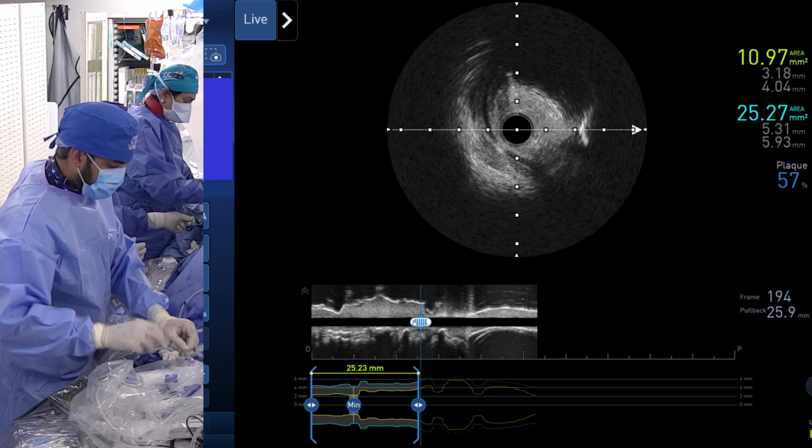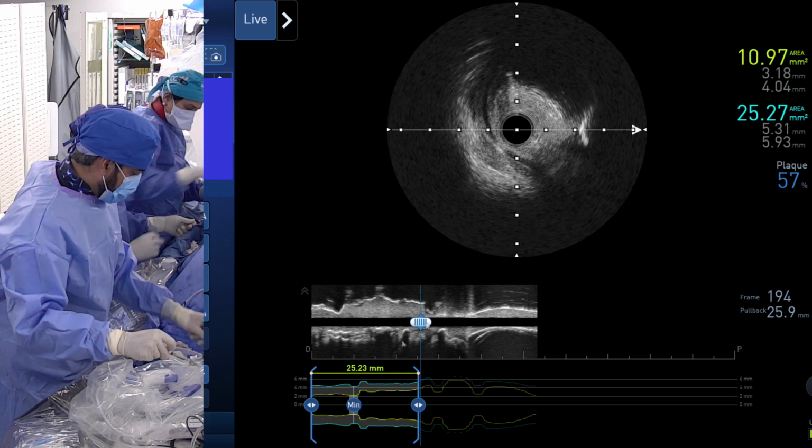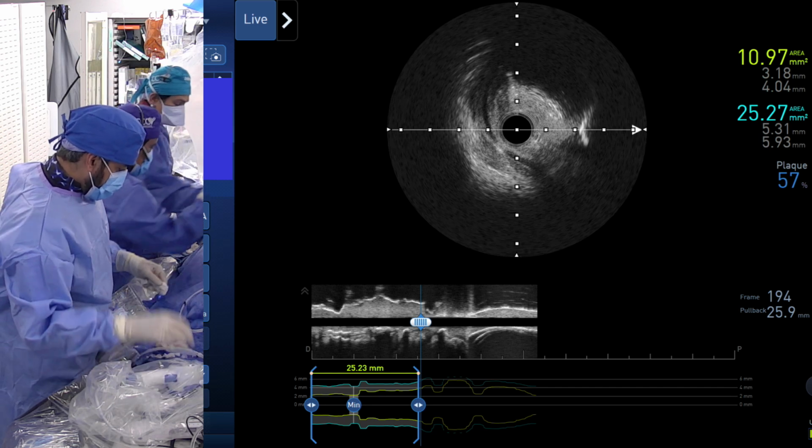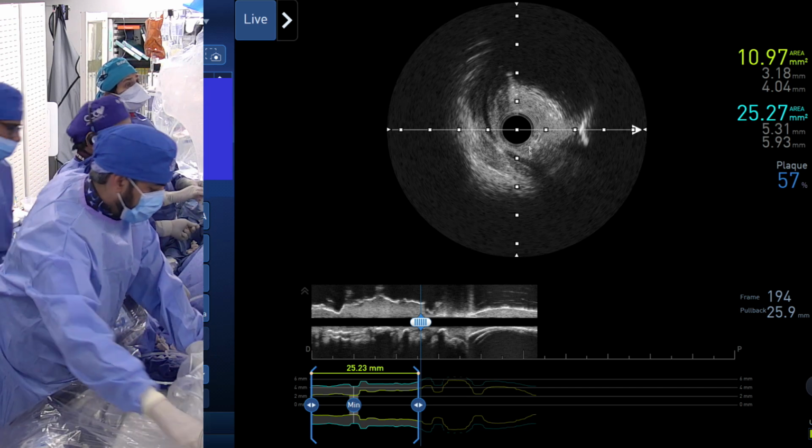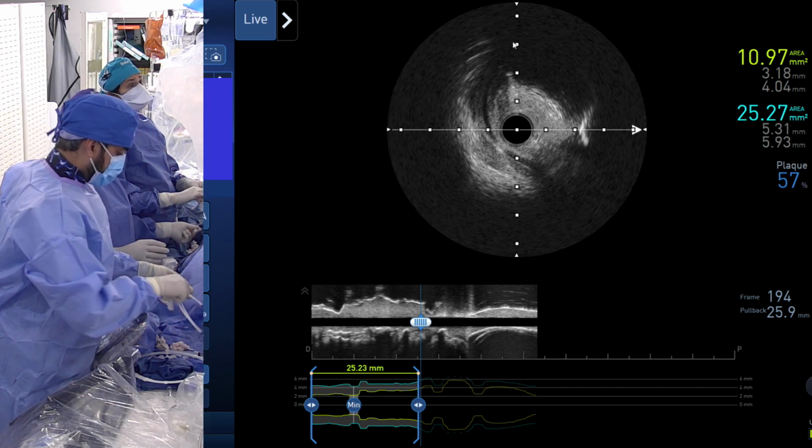So I'll remove the rota wire. Now, you want IVUS of the circ after doing the cutting balloon here? No, let's image first. Oh, you want to cut first? Okay. Yeah. So can you show the IVUS a little proximally? 1, 2, 3, a little 4, proximal.